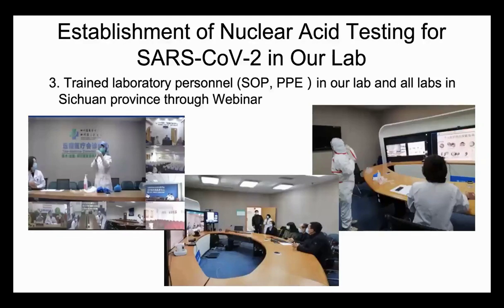So to ensure test quality and biosafety, we trained lab personnel in our lab and also in more than 300 labs in Sichuan province online. Also, our lab is Sichuan Provincial Center for Clinical Labs, responsible for providing EQA and guiding lab quality control.